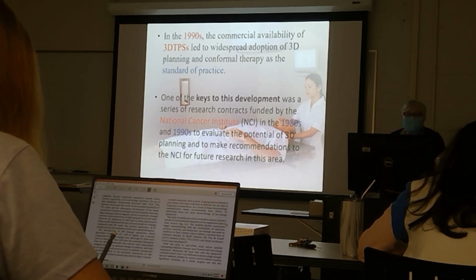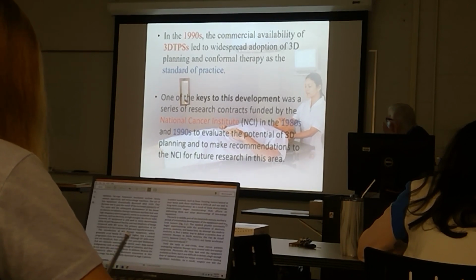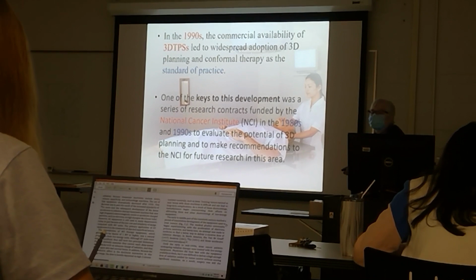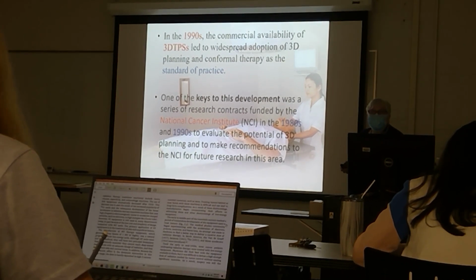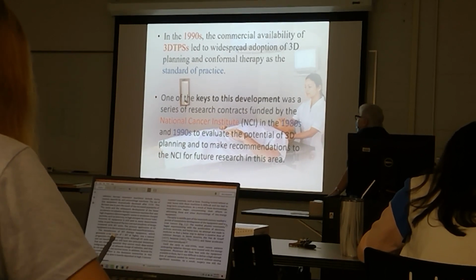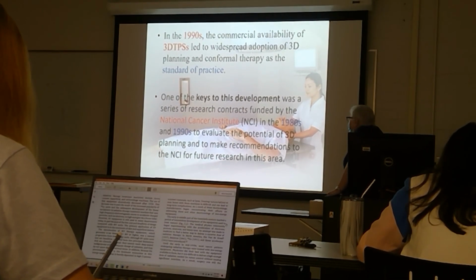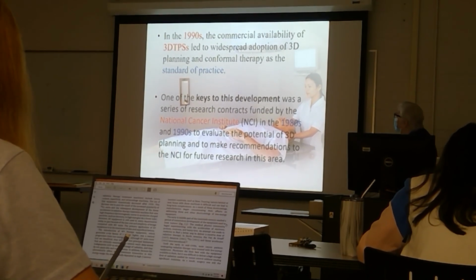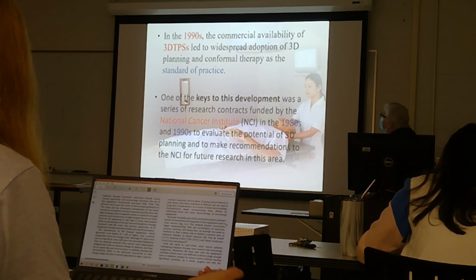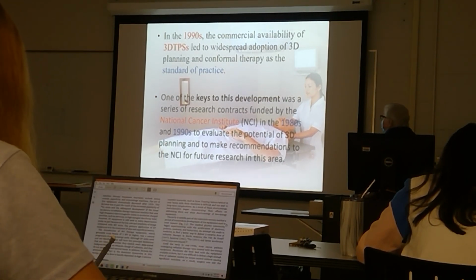So, 3D treatment planning systems in the 1990s. The National Cancer Institute, the NCI, wanted to evaluate 3D planning to make recommendations. So they came up with this 3D planning, and it has now become, or at that point was, standard of practice.